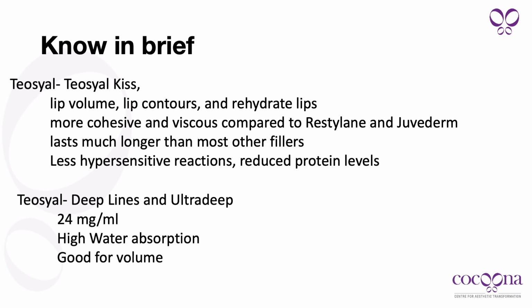But I restricted its use to very deep nasolabial folds with thick skin, or cheek enhancement or chin enhancement. But like I said earlier, it has a risk of displacement. So you have to use small boluses of the fillers and not so much volume in mobile areas like the periocular areas.